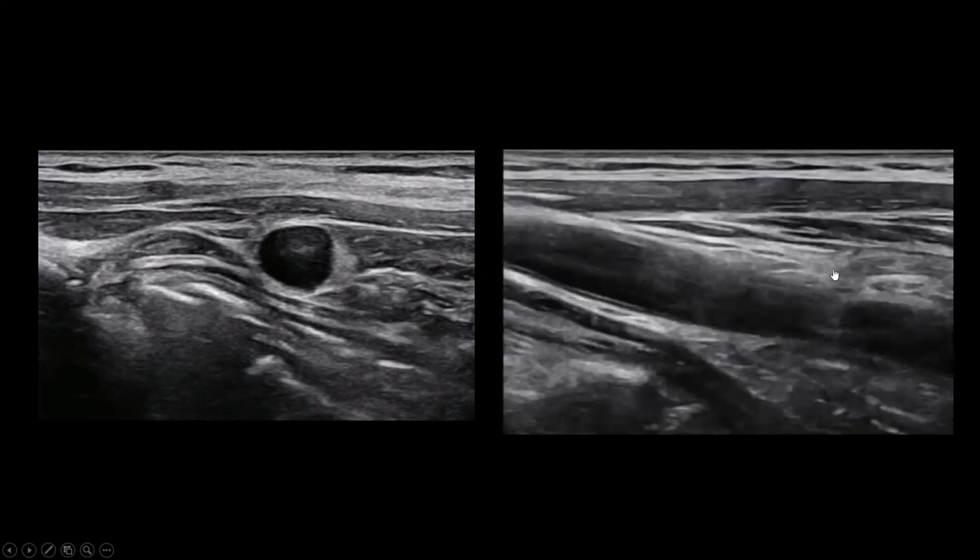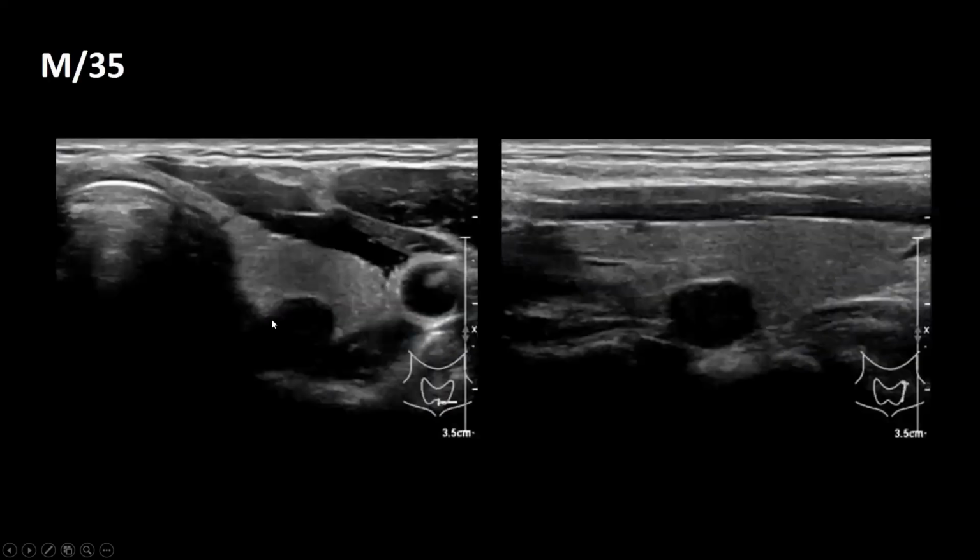This patient was referred for FNA due to a thyroid nodule at the outside clinic. The first FNA result was atypia. At the time of the follow-up FNA, I performed an ultrasound on the patient. I did an FNA with a parathyroid hormone test at FNA washouts because the lesion can be a parathyroid lesion.